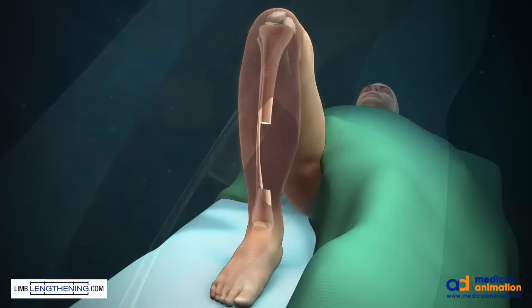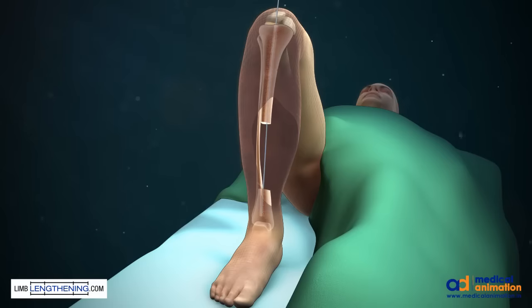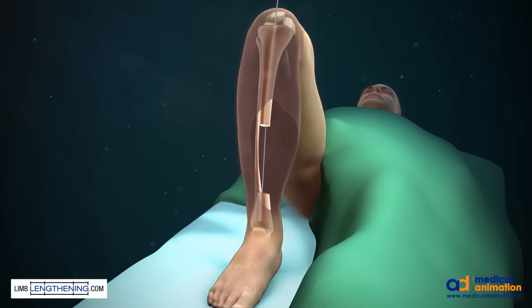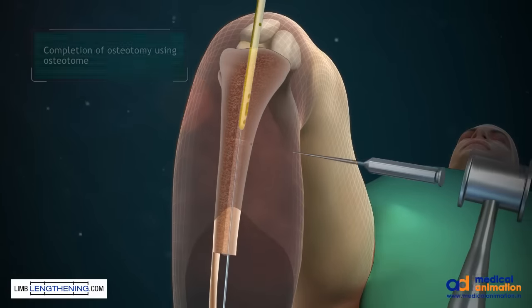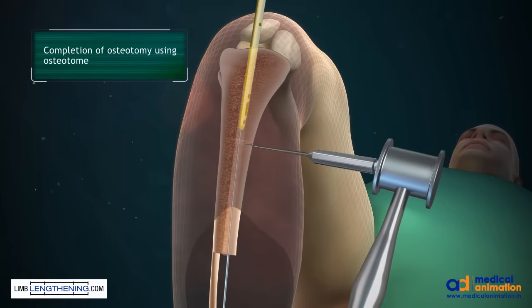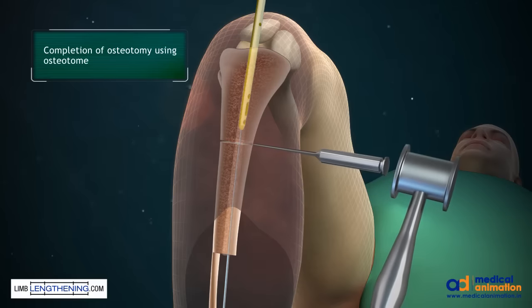This will also allow for deposition of reamings during the preparation of the intramedullary canal for the tibial rod. The tibial rod for the intramedullary nail is prepared as per routine. The nail is passed in the proximal segment and the osteotomy is completed using an osteotome.